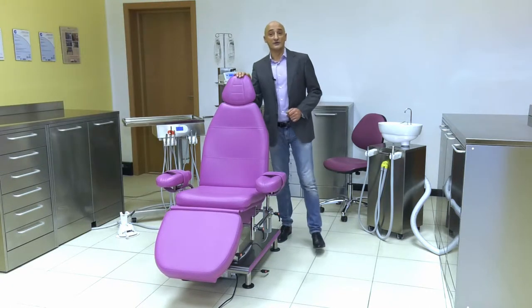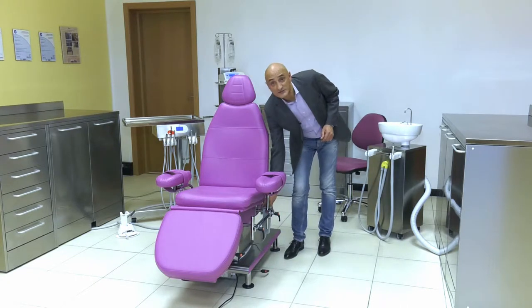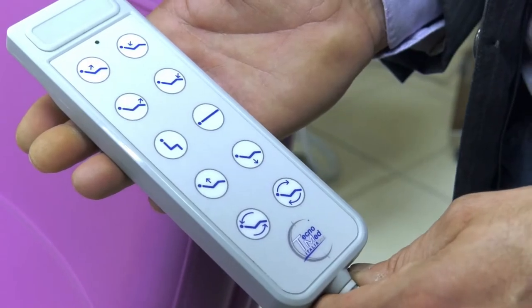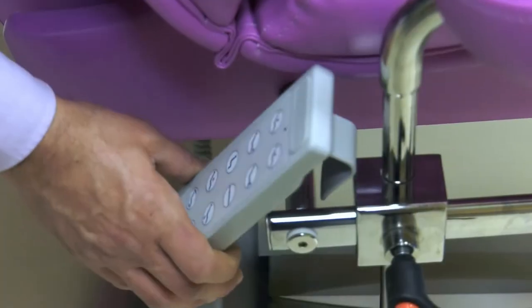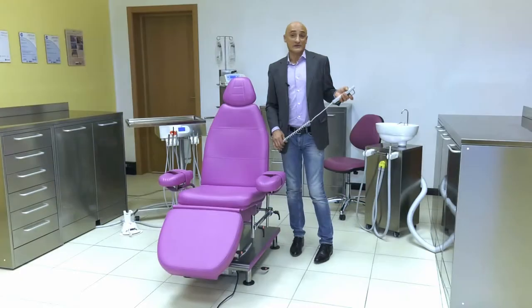In addition to the two foot levers, we have also equipped our Morpheus chair with a ten button remote control, which can be hooked onto the left side or the right side, as it has a spiral cable and can be used by the doctor or the assistant.